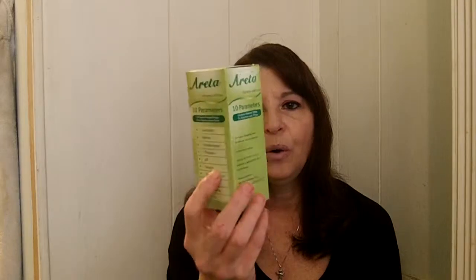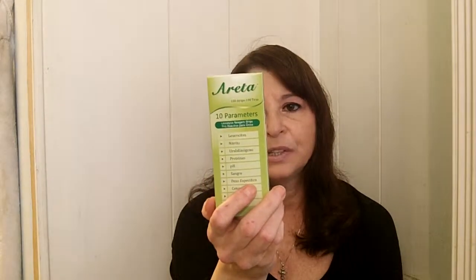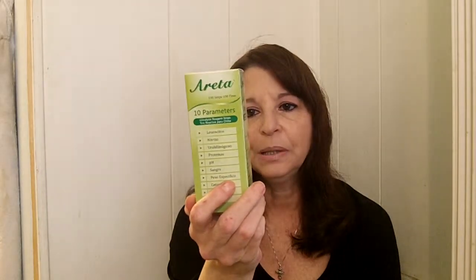Now this covers a whole lot of stuff. It will test for leukocytes, nitrite, urobilinogen, protein, pH, blood, specific gravity, ketone, bilirubin, and glucose.